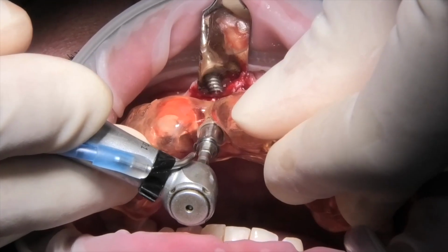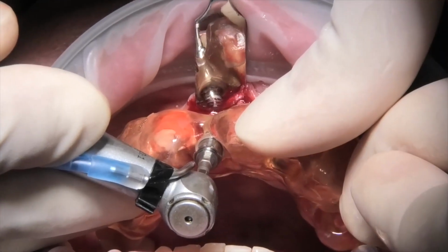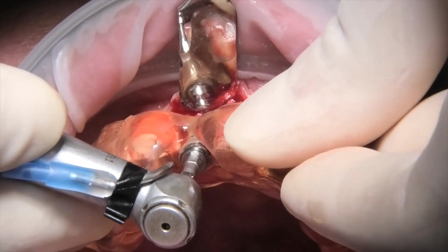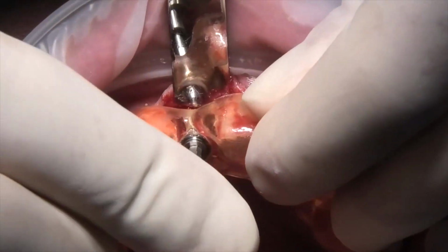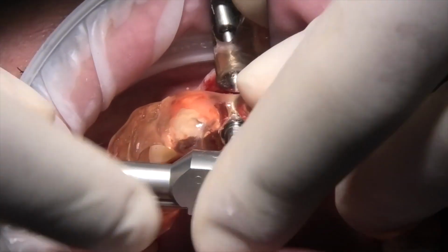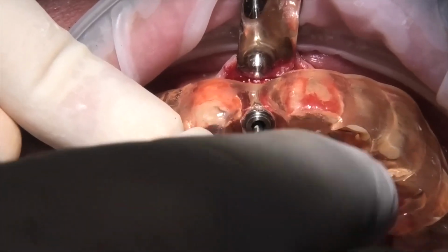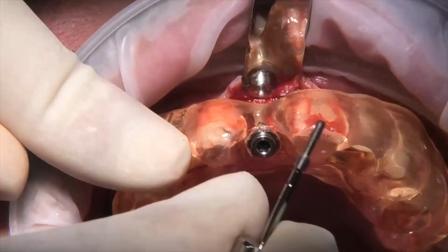The implant chosen is an Evolution implant with a 1.5 millimeter machined neck with integrated platform switching and a tapered body with a double thread, quite aggressive on the bone tissue. A versatile implant in every clinical situation, which always allows you to find an excellent primary stabilization. Once the torque of 45 newton centimeters with the physiodispenser is reached, you switch to the torque wrench until the implant is correctly seated with a final torque of over 60 newton centimeters.